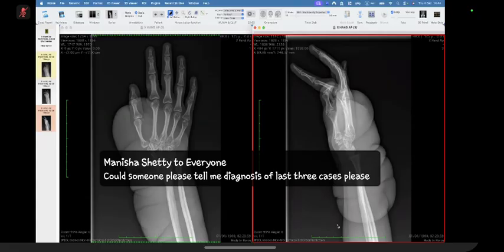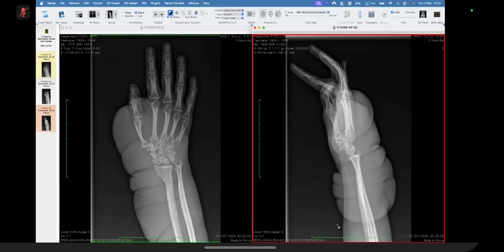So that's why I didn't like any. Okay. I excluded the scleroderma. Okay. No, that's fine. That's fine.